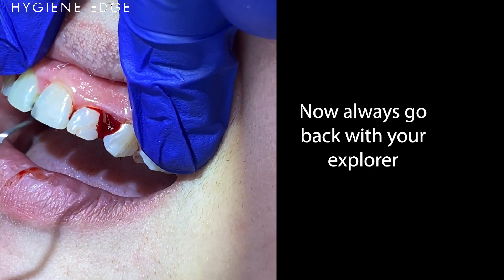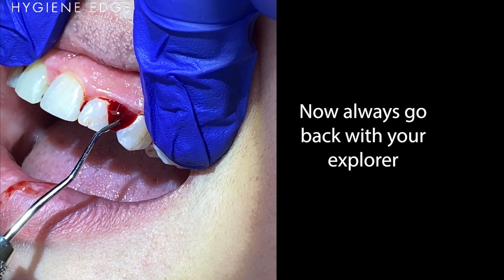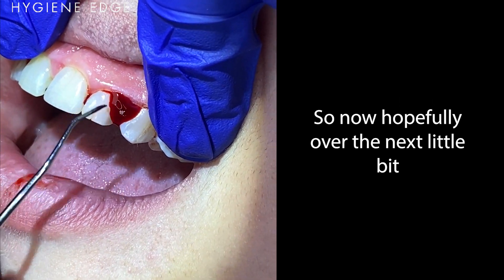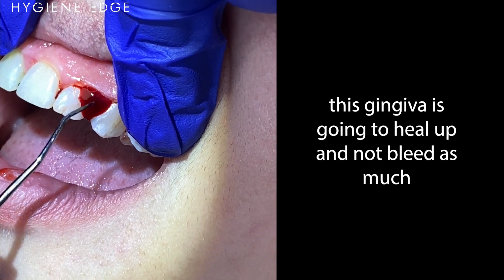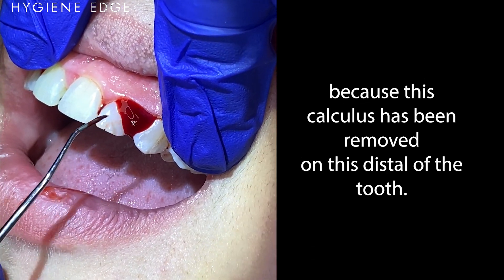Always go back with your Explorer. There we go. Hopefully over the next little bit this gingiva is gonna heal up and not bleed as much, because this calculus has been removed on the distal of the tooth.